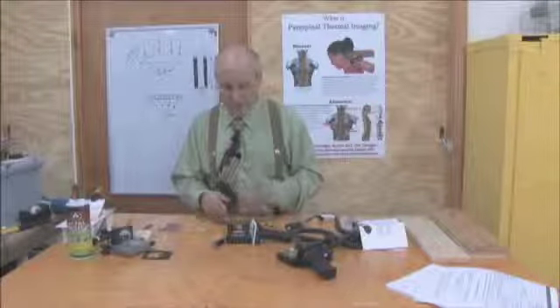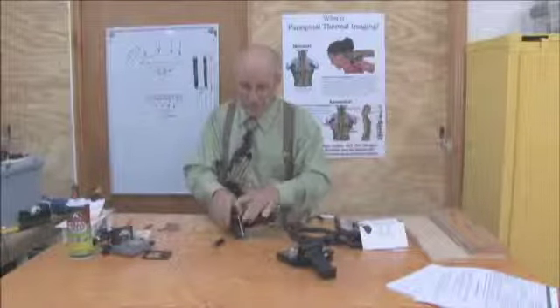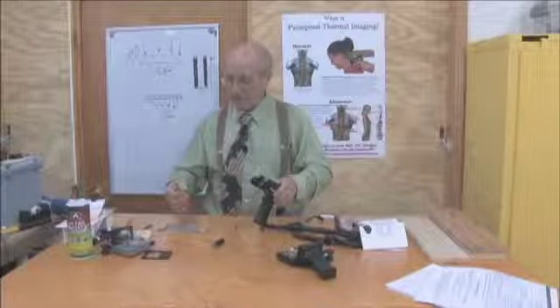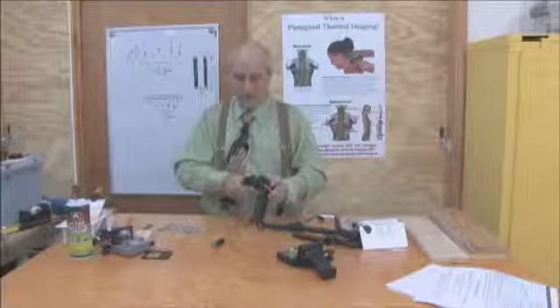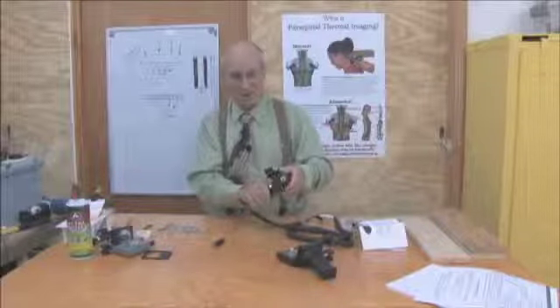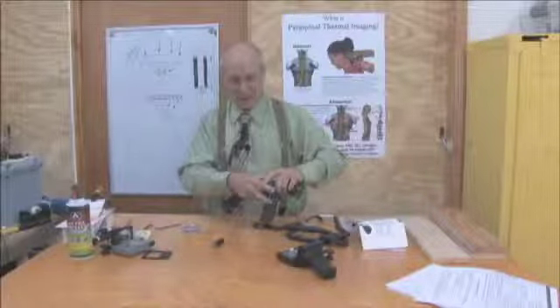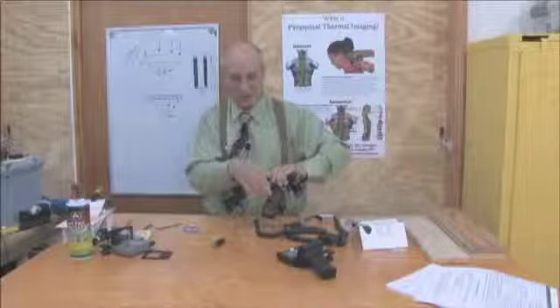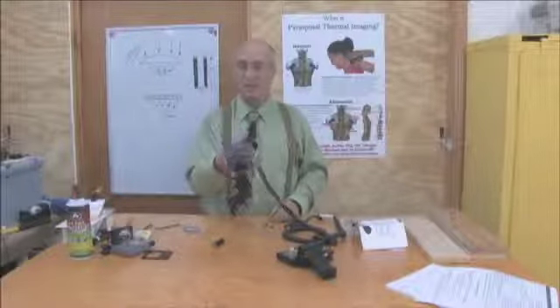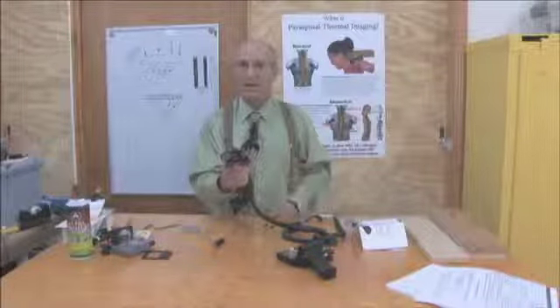If a scanner falls apart and you're in the middle of the day and it appears that all the wires are still attached, simply put it back together. Please do not use duct tape. You would not believe how long it takes my technicians to remove the residue from duct tape when a scanner's been duct taped. 1 or 2 rubber bands will do the job. You can finish the day, get to the weekend when you can mail the scanner in, or, as I'm going to show you, you may very well just fix it yourself. If the scanner still works and it's taped together with rubber bands, fine, continue to use it.